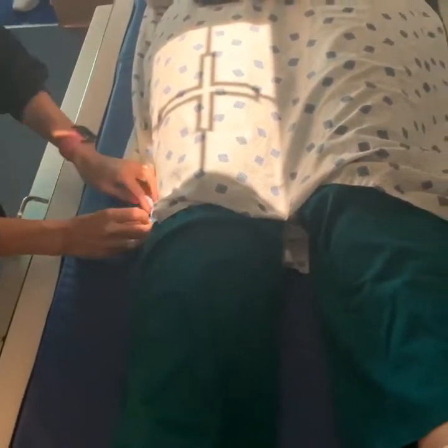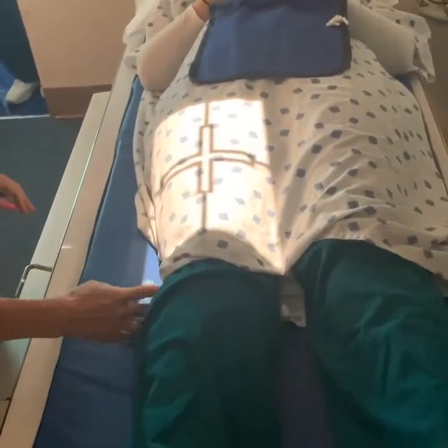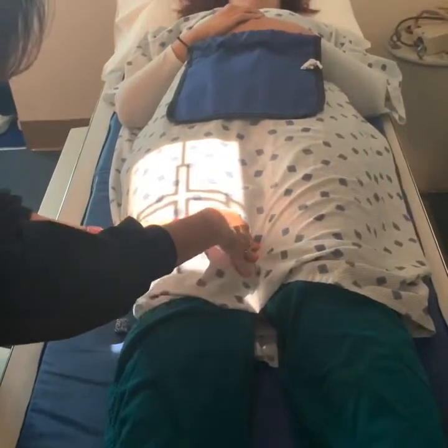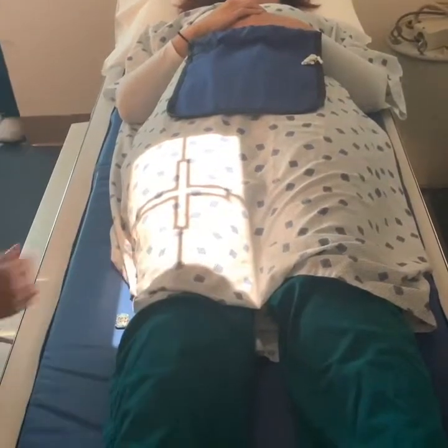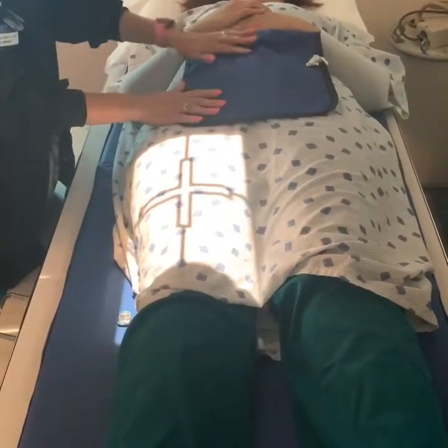The only difference with that is we usually angle based on the thighs and buttocks. This is right. I'm just gonna put it lateral to the part, so I'm gonna stick it right there in the light field on the table. We've got it right in the middle of the leg. We're including the knee joint. We're set at 80 at 12.5. We'll shield her on this one.